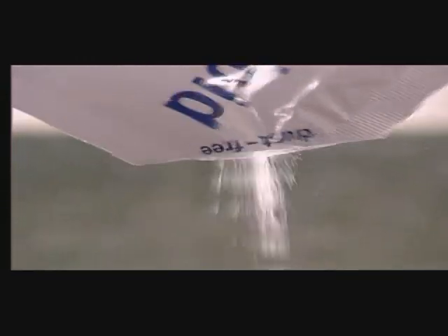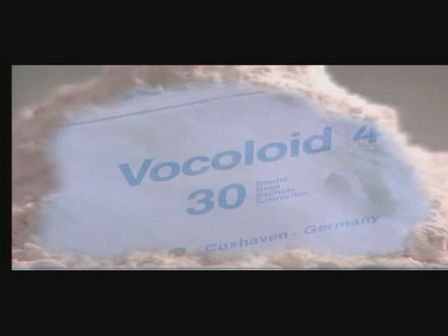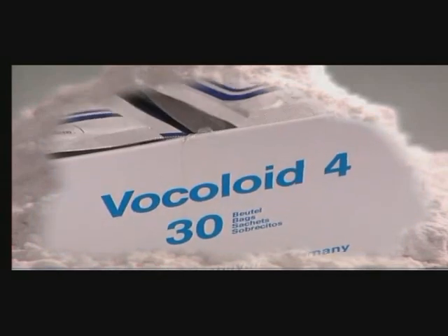The impression material for diagnostic and planning models is alginate. It has sufficient detail accuracy for these requirements. The reactive portion of the powder consists of water-soluble salts of alginic acid, which is obtained from marine algae. Alginate comes in various forms of administration.